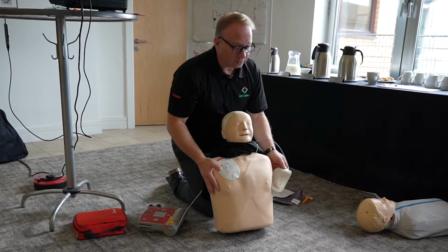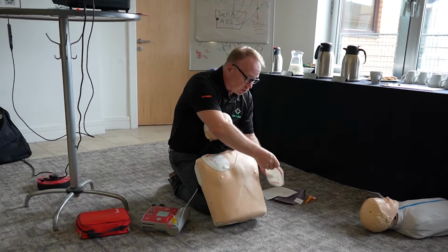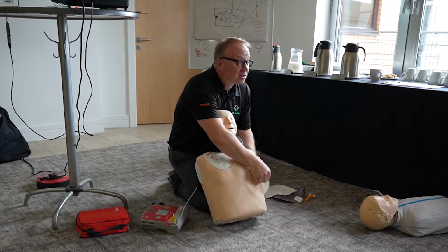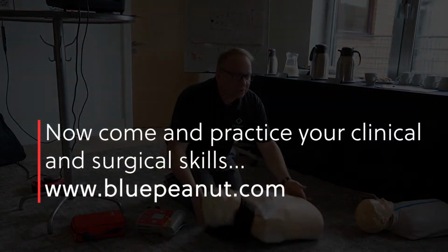If somebody lies down on their back and the breasts fall to one side, can you put this over the top of the breast? It won't make a proper connection. So you have to move the breast out of the way and then put it on. So be aware of that. Okay. Any questions?